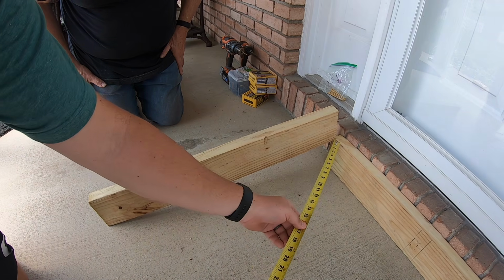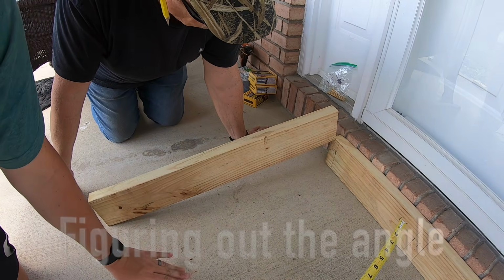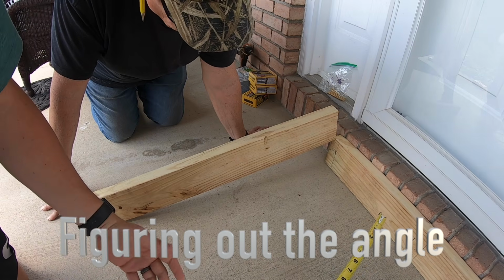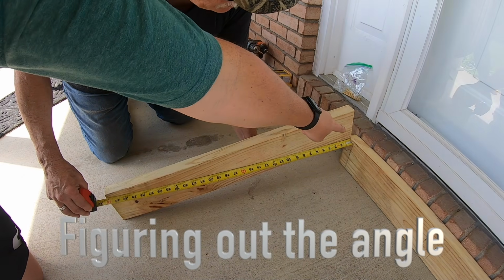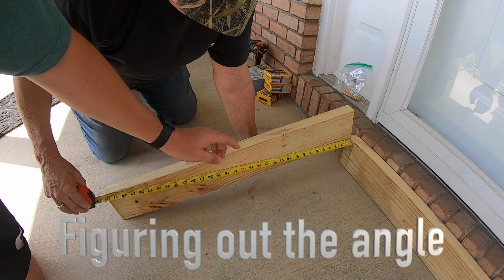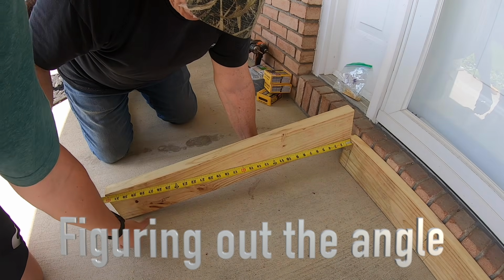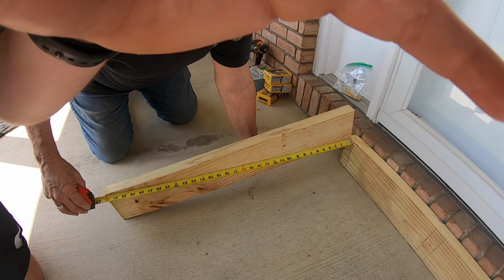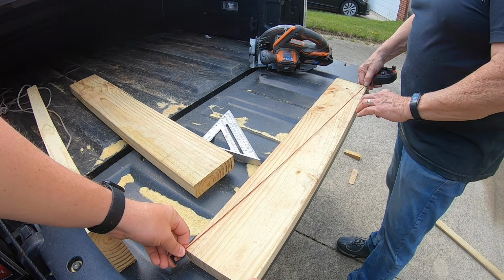This is where you do have to use a little bit of math and be able to figure out exactly what this angle is. So by the end of the run, your board is sitting as flat on the ground as possible, so you don't have a huge lip, but there always will be some kind of a lip. That's just the way it goes. So one of the easy ways to do this is go ahead and take from the top of your header all the way to the very top of your runner. It's kind of weird, but it will give you the angle that you need. That will help you get exactly what you need so you have the correct angle. So again, we're gonna take it, remember, from right here all the way down to that other end, and that will give us the run that we need.